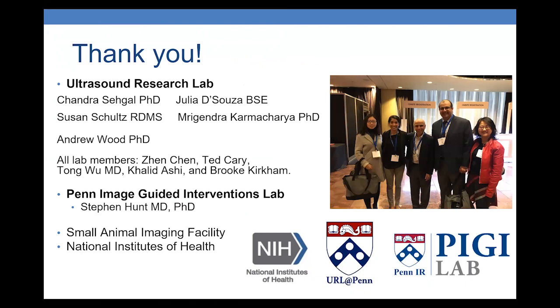Yeah, exactly. It's been used lately, and FibroScan is also an example of using elasticity. But we wanted to go with something more accessible, easier, less expensive. So nothing easier to find than just B-mode ultrasound using our quantitative measurements. So we were hoping, with these findings, and maybe doing more studies, that this system can be established in the future.